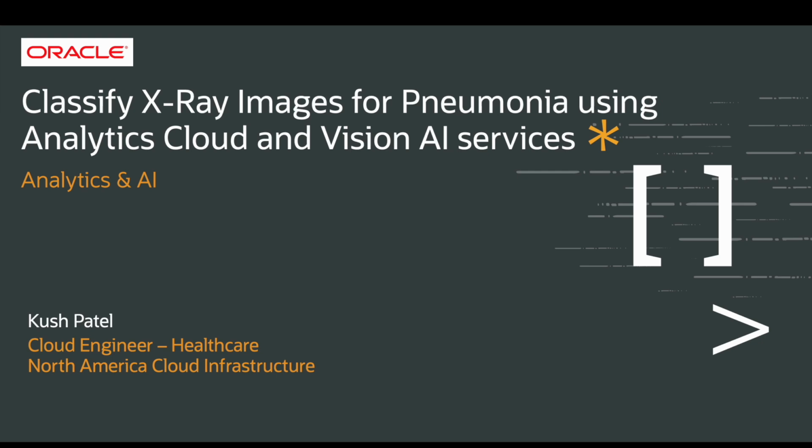I'm a cloud engineer dedicated to healthcare organizations that falls under North America Cloud Infrastructure. In today's session, we'll be discussing a demo called Classify X-ray Images for Pneumonia using Analytics Cloud and Vision AI services, which come under Oracle Cloud Infrastructure Analytics and AI services.